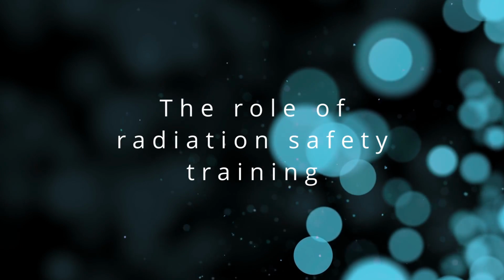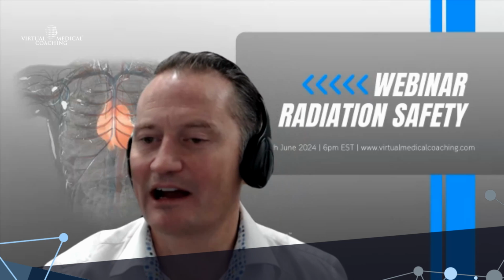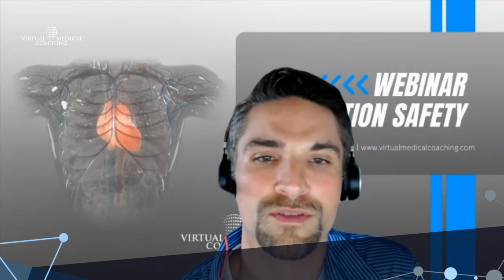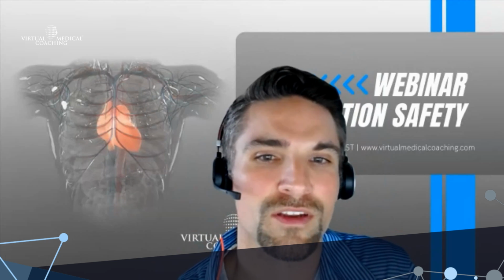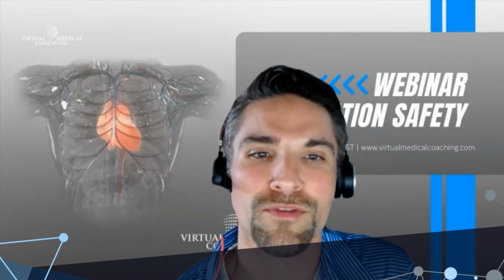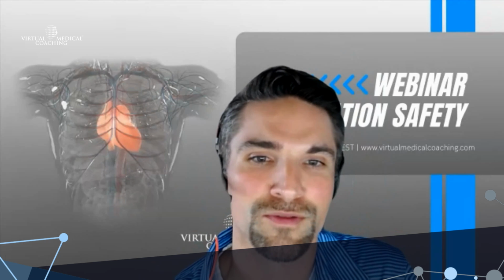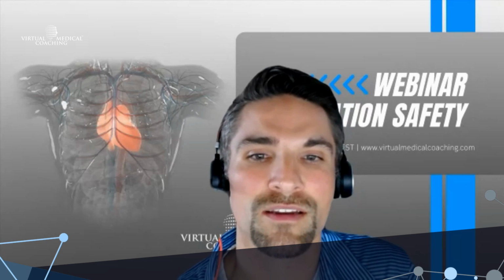So Jason, what role does radiation safety training play in protecting patients from unnecessary radiation exposure? And how does it align with the ALARA that you teach? Yeah, I think radiation safety training is vital for all students and others as well. It teaches them the importance of where to stand for a specific fluoro procedure. If you're in a cath lab or an IR room, making sure that everyone is wearing lead aprons before you start any procedures, making sure they have their thyroid shields and their dosimeters outside their lead aprons, and making sure to distance yourself as much as you can.